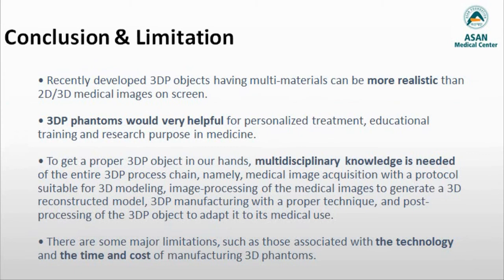With the development of inexpensive 3D printers, 3D printable multi-materials, and 3D medical imaging modalities, 3DP medical applications have come into the spotlight again. Due to the availability of transparent, full-colored, and flexible multi-materials, 3DP projects can be more realistic, mimicking the properties of the real body, not only hard tissue alone, but also hard and soft tissue together.